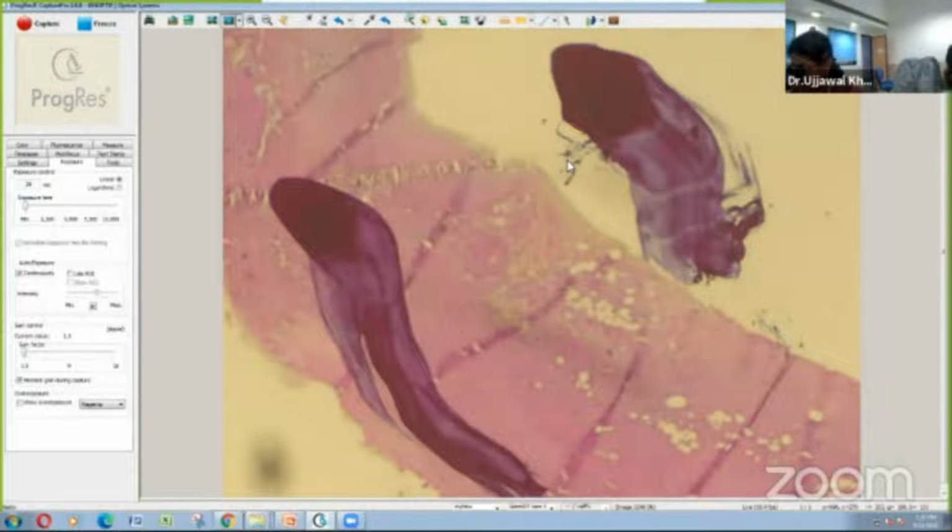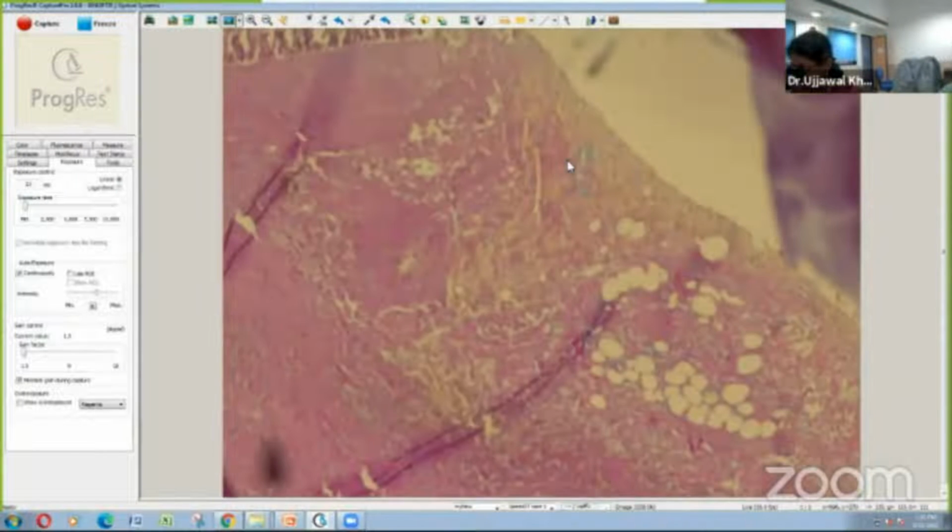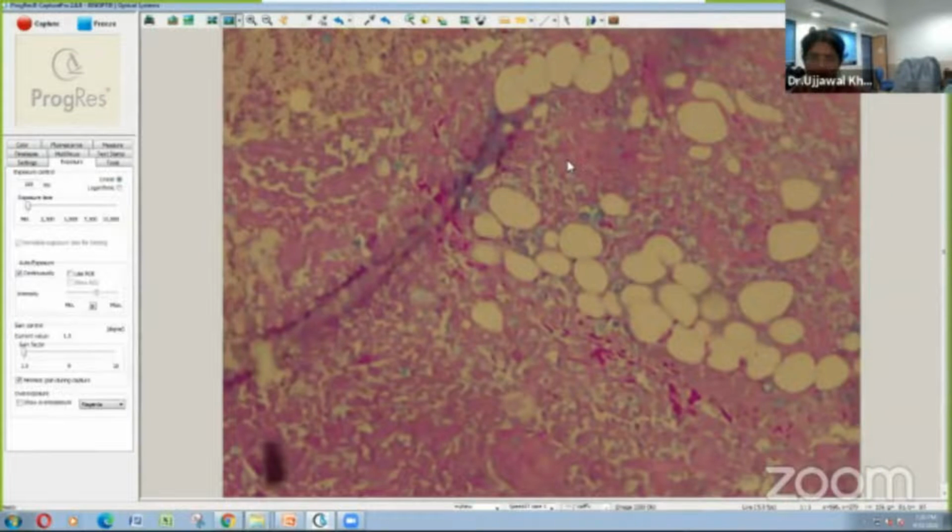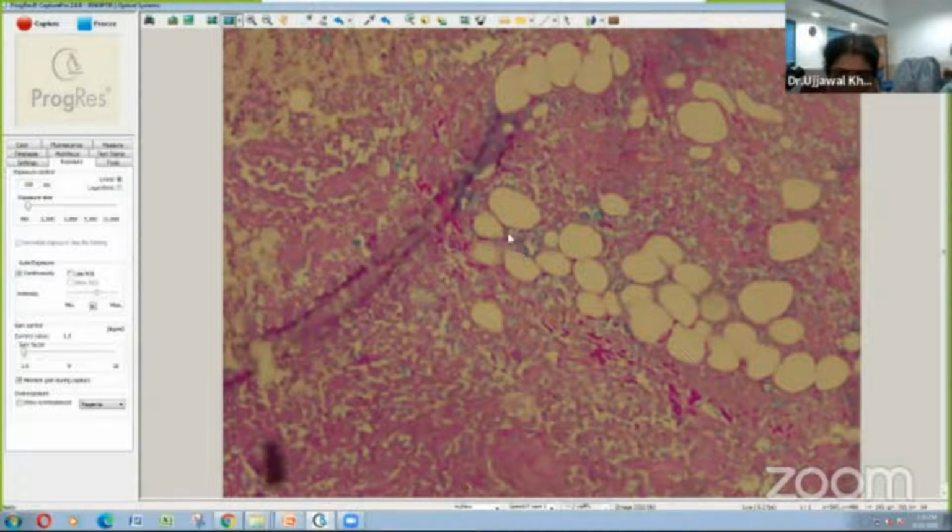So, deep fungal infection. Cryptococci can have gelatinous inflammation or no inflammation, and because of the immunocompromised nature of the patients, can have a granulomatous response. In this patient, we had this gelatinous cryptococcal cellulitis. We can see the yeast is pink in color and the capsule is ashy blue. So skin is a mirror of systemic cryptococcal infection. One must remember this. Needless to say, this is cryptococcal cellulitis.